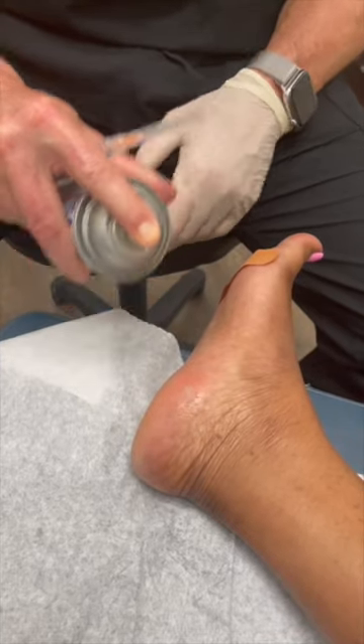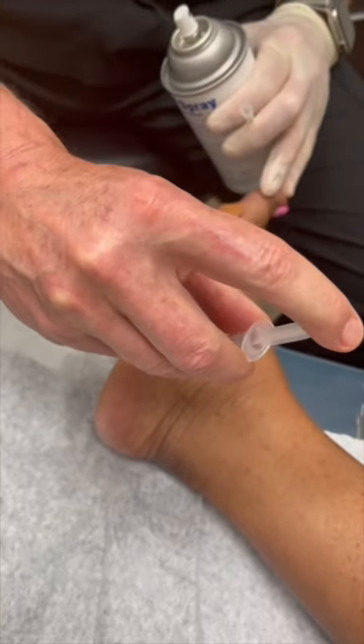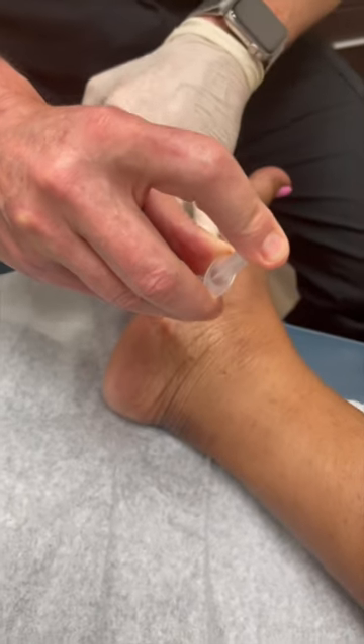As soon as I get a little white spot, we zip it on in — one, two, three — and just slowly inject in here. Stings a little bit, but she's brave.